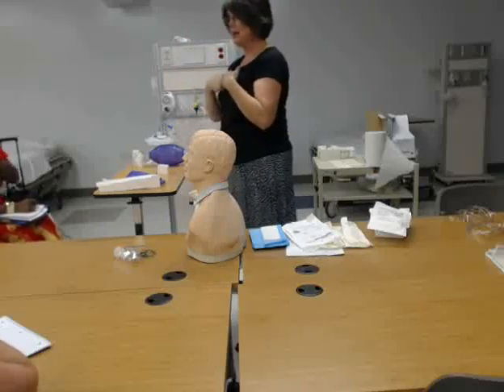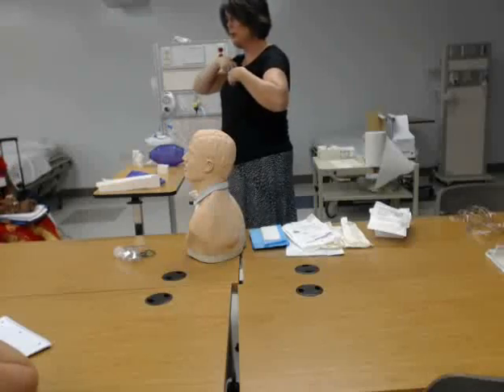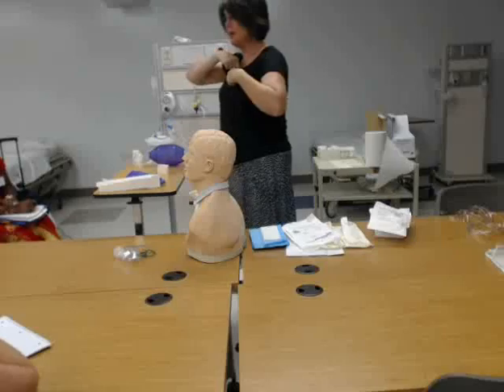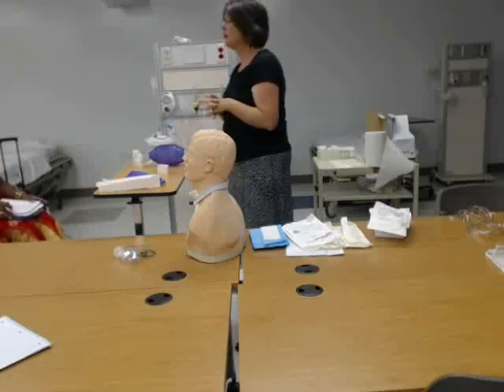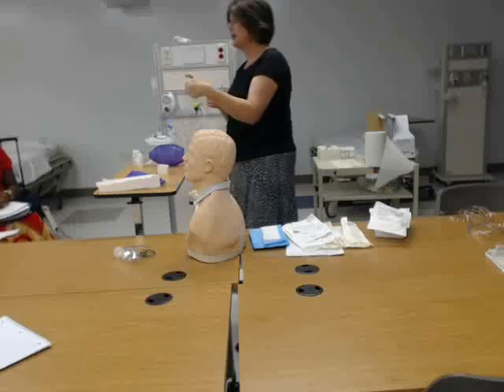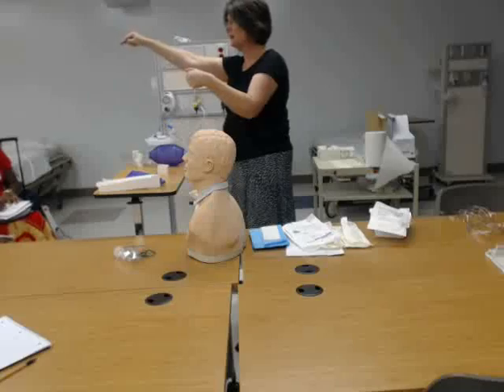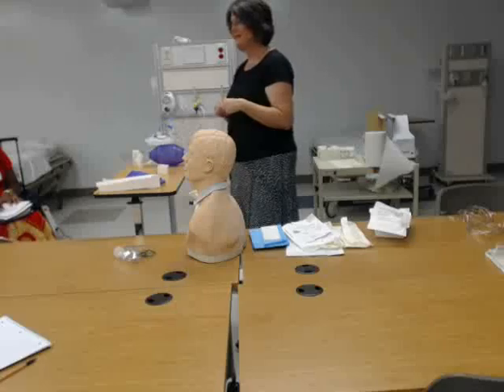If you think about the trachea, at some point it ends right about here and it bifurcates into the two main bronchi. When you're inserting the catheter, you can't go into it like a bronchi — so you're going to meet resistance, it's going to stop. You're going to feel like you can't get it in anymore. That's when you want to pull it back up about a half an inch and then start your spiral out. The whole thing is one big suction device — when the hole is covered, now it's sucking from the tip at the end.